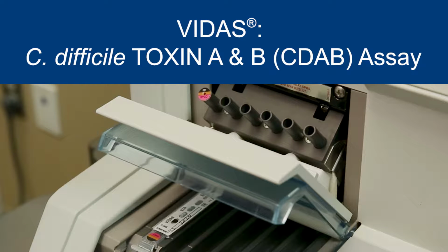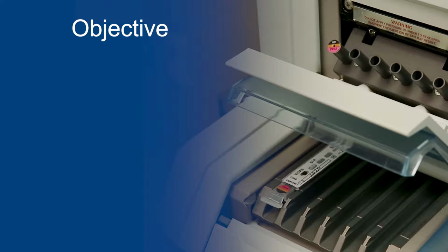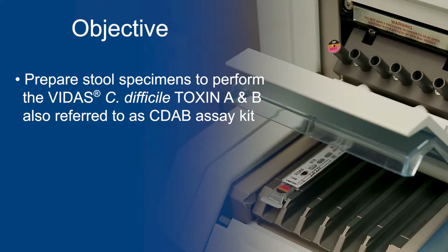This video describes the steps to prepare stool specimens to run on the VIDAS instrument using the VIDAS C. difficile Toxin A and B CDAB assay kit. At the end of this video, you should be able to prepare stool specimens to perform the VIDAS C. difficile Toxin A and B, also referred to as CDAB assay kit.